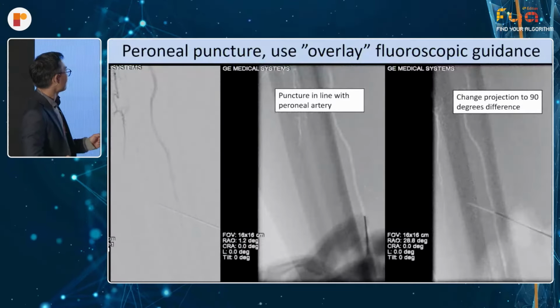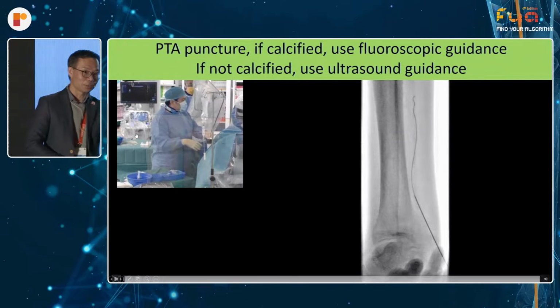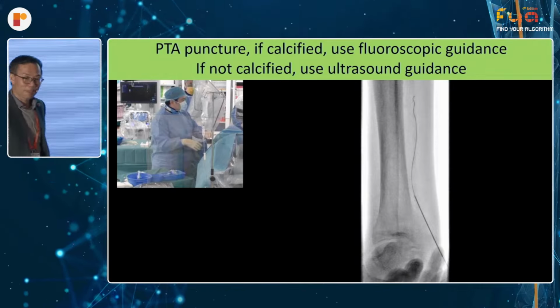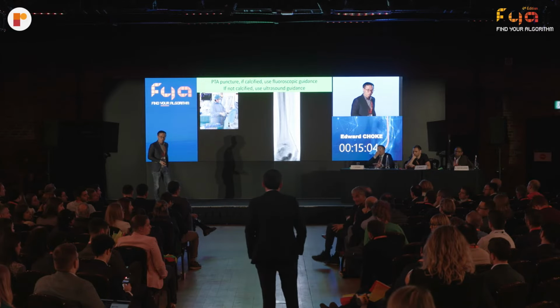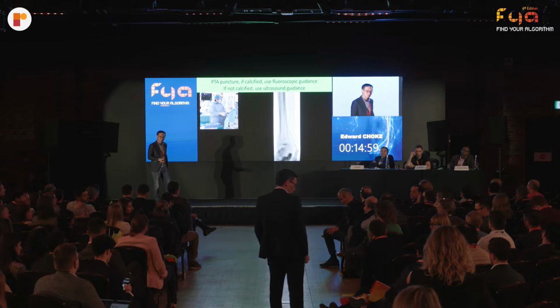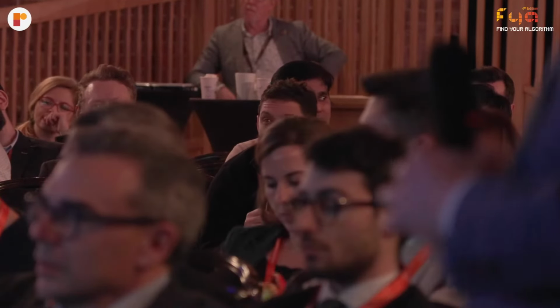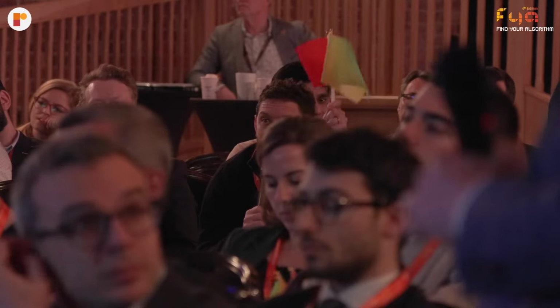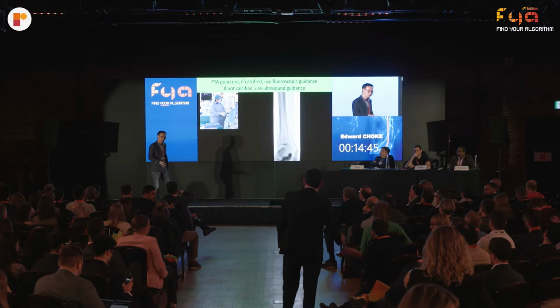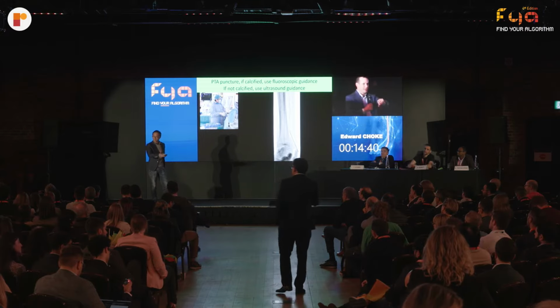If it's not calcified, then I will use ultrasound guidance for PTA. You were going to mention something about PTA retrograde punctures, was there? No, it's fantastic. I completely agree. Just for me, because it's so mobile, the PT, this is when I puncture longitudinally to stitch the wire and do a true Seldinger, go through and through, then pull back and visualize the guide wire under ultrasound up the artery. That's the main difference for me between a DP puncture and a PT puncture. Also because the anatomy helps you. You put the probe nicely, but on the DP, it's difficult to put the probe, it slips.